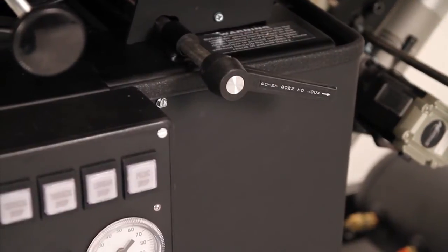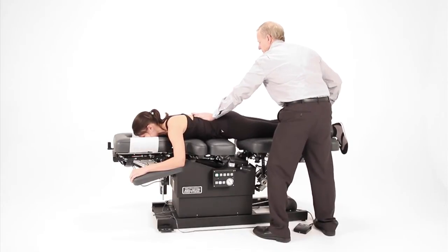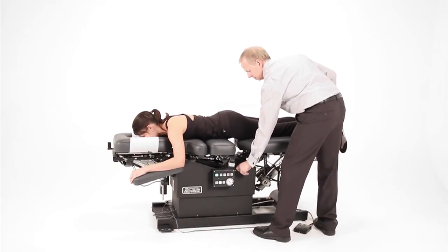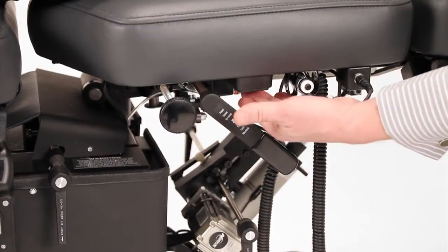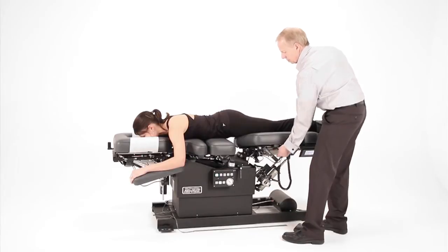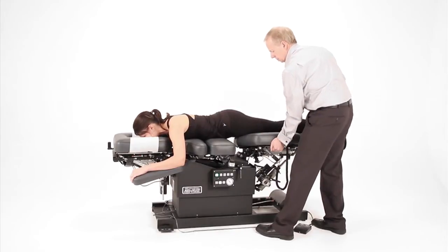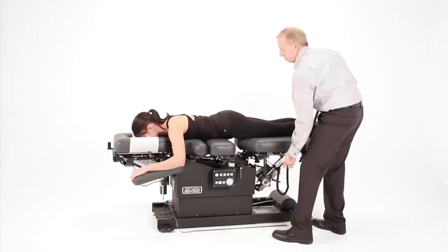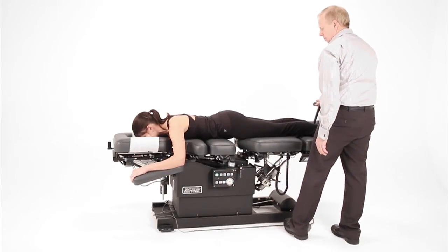To use lateral movement with flexion, disengage the lateral handle counterclockwise. This combination will allow you to perform smooth and effortless circumduction. The table also comes with rotation, which uses a double locking system. Disengage the large centering handle, and then unlock the switch to rotate the pelvic section freely. From there, you can treat at a specific rotation angle by locking the switch. When the treatment is finished, select distraction and use the pressure pedal to retract the table and your patient inwards.